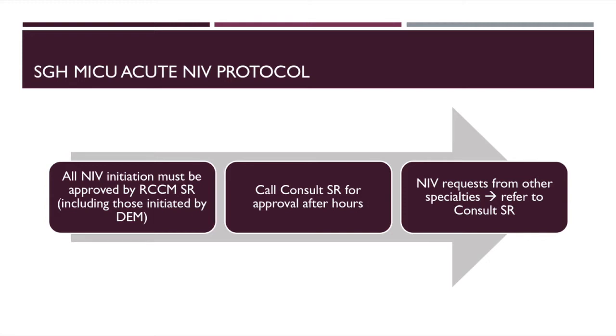If you need to initiate NIV on call, call the RCCM Consult SR for approval. This includes NIV started by ED and other non-medical specialties.